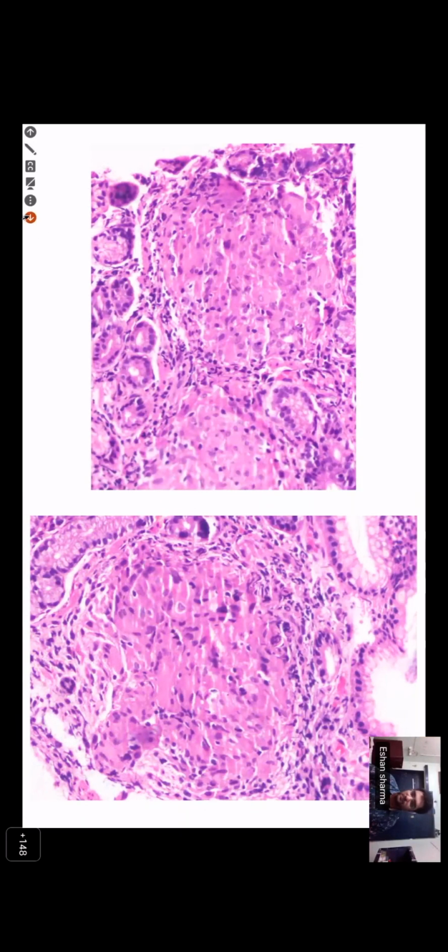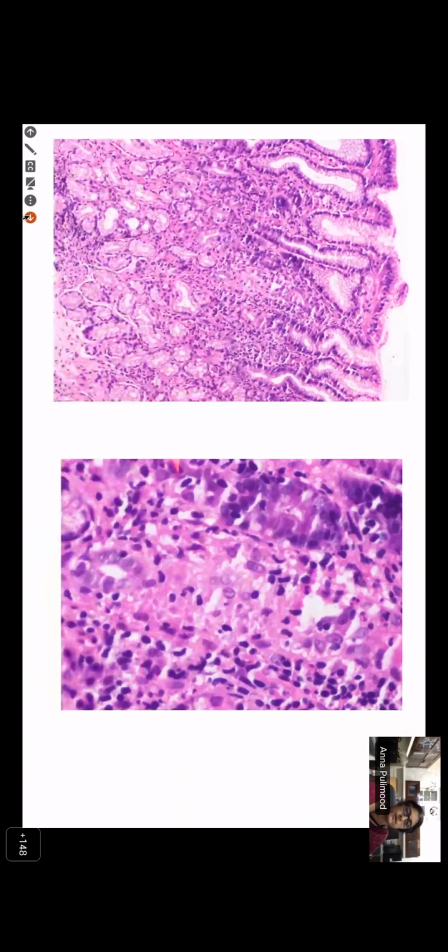Okay. So no lymphoid cuff, no caseation or necrosis, no inclusions. Some aggregates of histiocytes, which are not really a granuloma, in this area. You're seeing some histiocytes, but they're not forming granulomas.